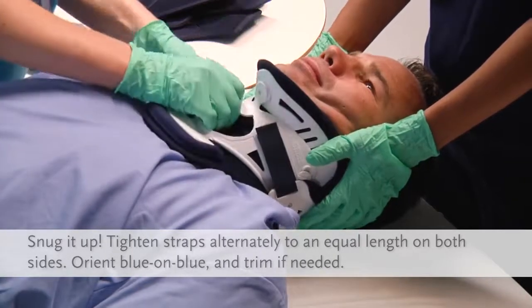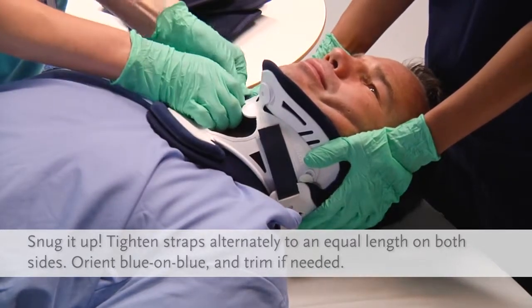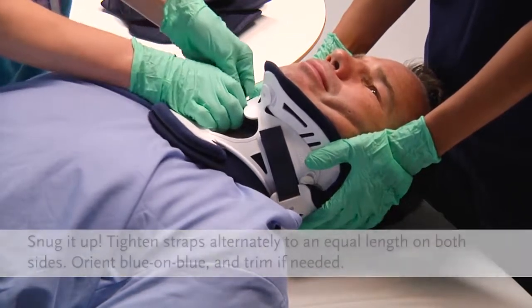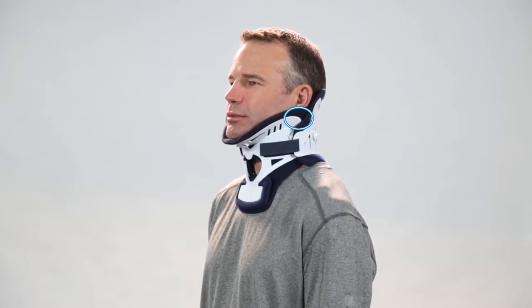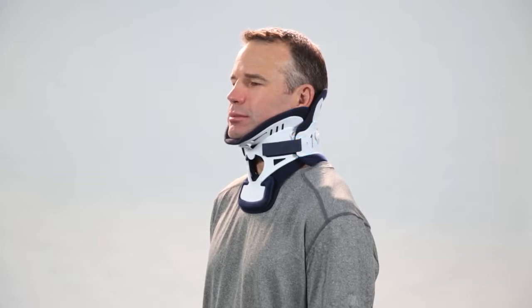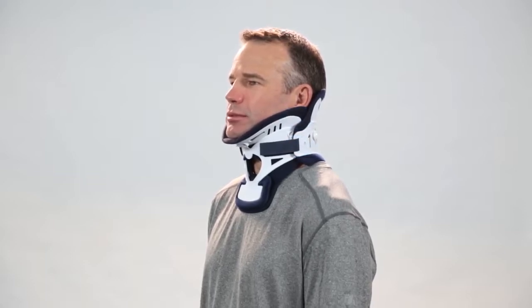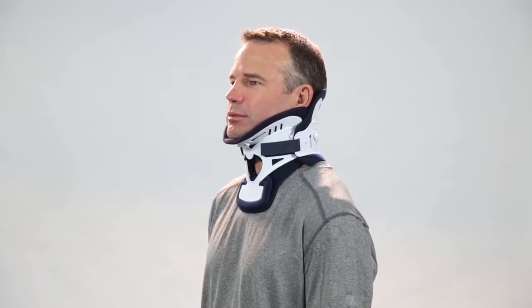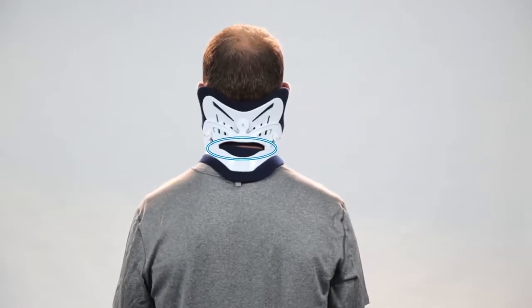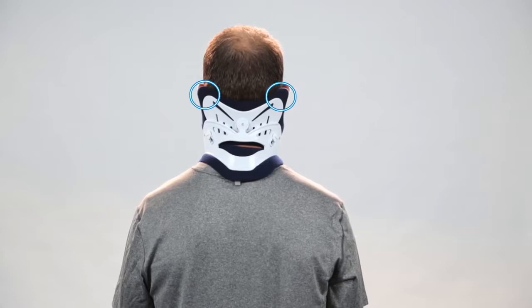Velcro straps should be aligned and oriented blue on blue to the front adhesive sections. There should be equal amounts of excess Velcro overhanging, which may be trimmed if need be. A properly applied Miami J will look like this: the collar extends from the mandible to just below the sternal notch; the chin is centered comfortably in the chin support and does not extend over or within the chin support. The front of the collar should be angled up towards the ears, and the sides of the collar back should overlap the sides of the collar front. Lower plastic edges should not be resting on the patient's clavicles. Velcro straps should be oriented blue on blue with both straps the same length, with no slack or gaps. The collar back should be centered so that the tracheal openings and posterior vent are midline, and Sorbatex pads should extend beyond all plastic edges.